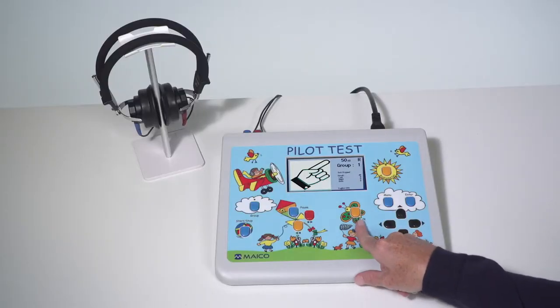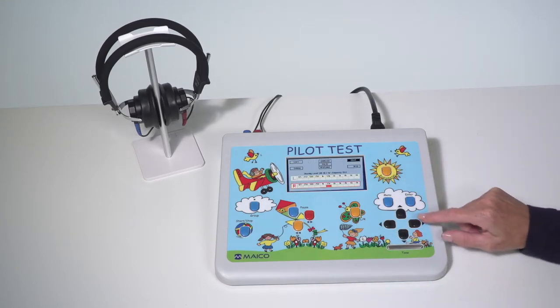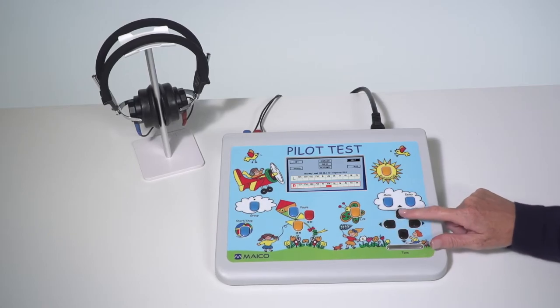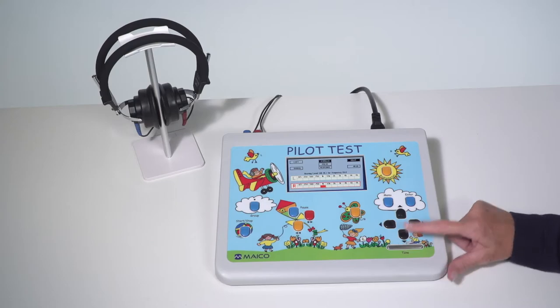Select the right or left ear with the ear selector in the butterfly. When performing a pure tone audiometry test, select the test frequency with the left and right arrows, select the volume level with the up and down arrows, and press the tone switch for one to two seconds to present the tone. To score the level, press the enter key.